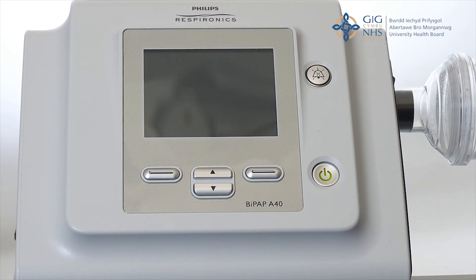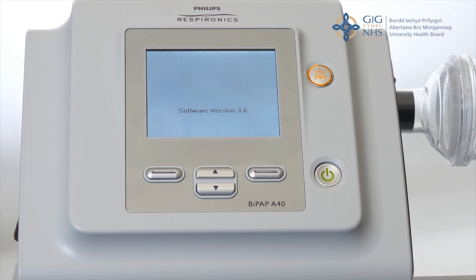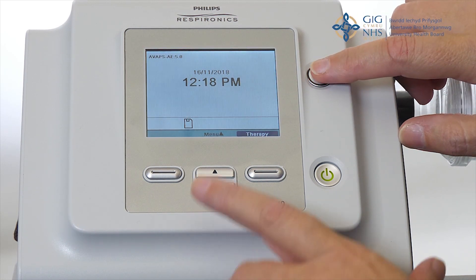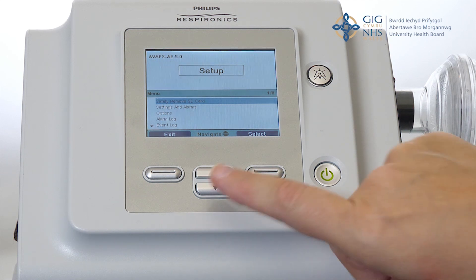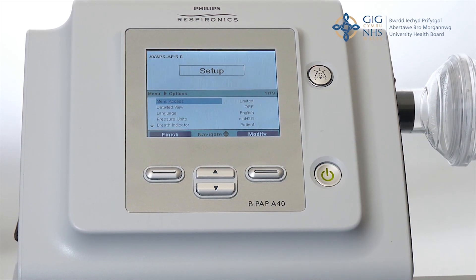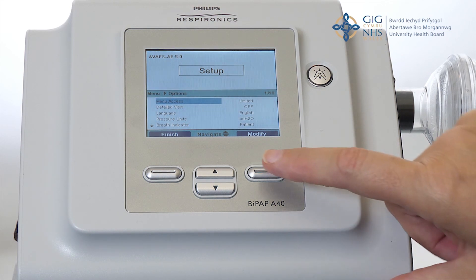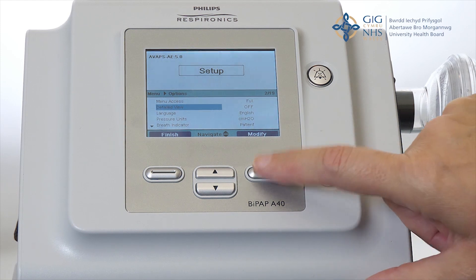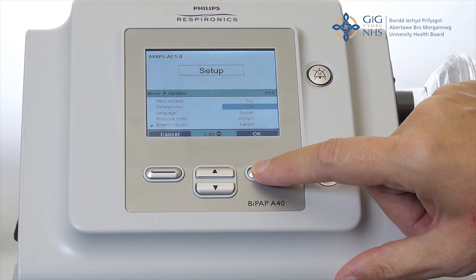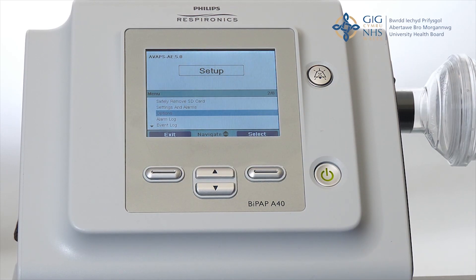So this is the A40 ventilator. Ensure it's connected to a power supply and then switch on the power button. Unlock by pressing the alarm button top right and the bottom arrows and hold simultaneously for three seconds until it beeps. Scroll down to options and using the navigate arrows press select. Menu access will be highlighted, press modify and then change to full and then press OK. Detailed view is now highlighted, press modify, change to on, and then press OK and then press finish. It's important to note that to make changes you need to be in full access and for monitoring you need the detailed view on. The machine is now unlocked and will remain unlocked until the access is modified back to limited.